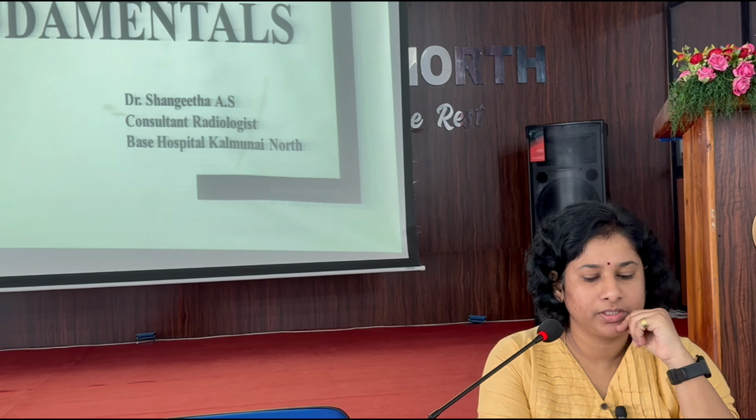So today's talk will be on chest X-ray fundamentals, which will be the basic knowledge to learn about chest X-ray for the medical professionals. In this talk, I would like to include types and techniques used in chest X-ray, quality assessment, normal versus abnormalities detected in the chest X-rays, how to approach a chest X-ray in a medical setup, and how to identify the lines and tubes.